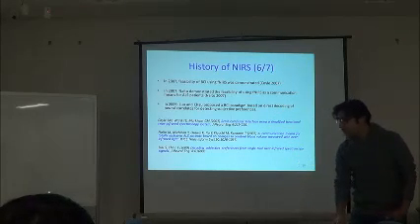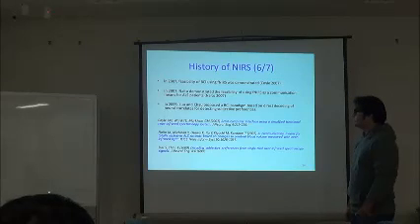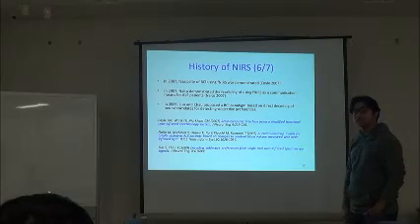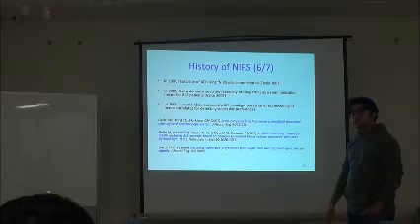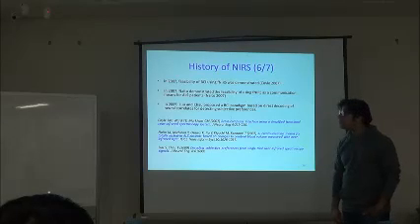And in the same year, a Japanese researcher, Naito, demonstrated the feasibility of using fNIRS as a communication means for ALS patients. ALS patients are totally locked-in patients, and there were around 40 patients.